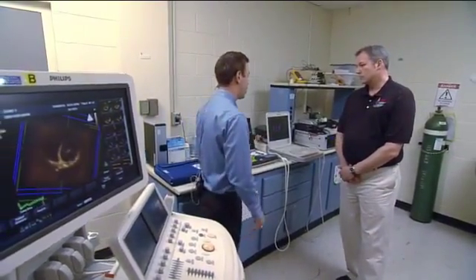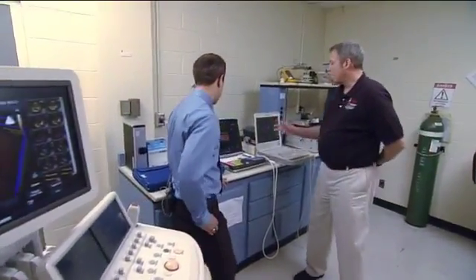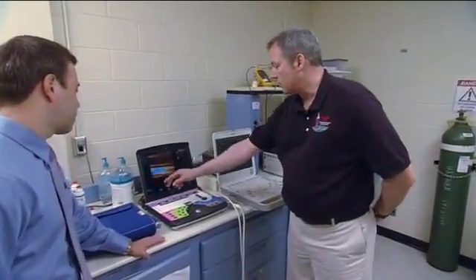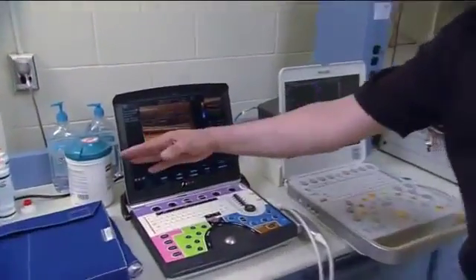Steve, talk a little bit about the upcoming experiment called, what is it, CardioOx? Yeah, CardioOx. You talked a little bit about ICV earlier, and that one is focused on the heart. CardioOx is focused on the blood vessels. Okay. And so we would get images like this. This is an image of a carotid artery, and you see these colors streaking by.